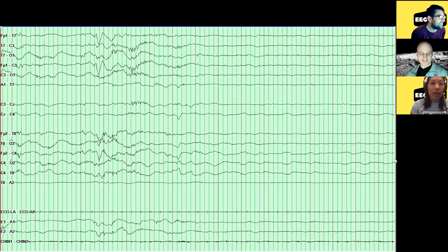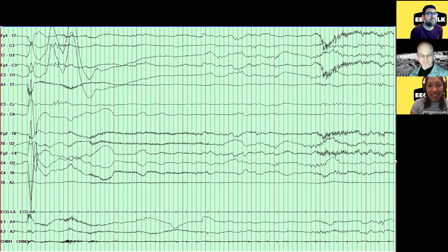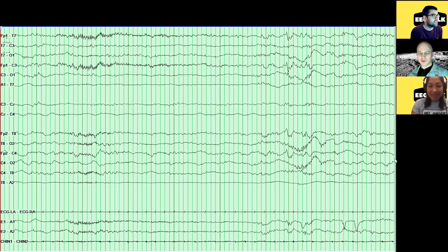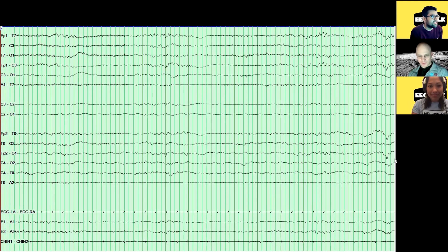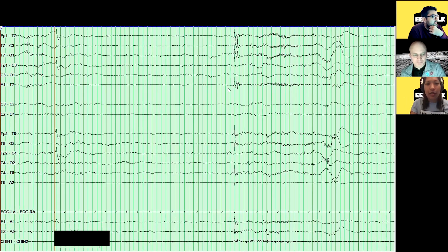Yes. In my report, I would call it a discontinuous background during sleep. I would still refer to an interburst interval because that's still accurate. The interburst interval on that chart, that refers to the suppression periods, right? How long the suppressions last? The flat parts. Exactly. When it kind of goes, you know, activity and then pretty flat. It looks pretty flat. Yeah.